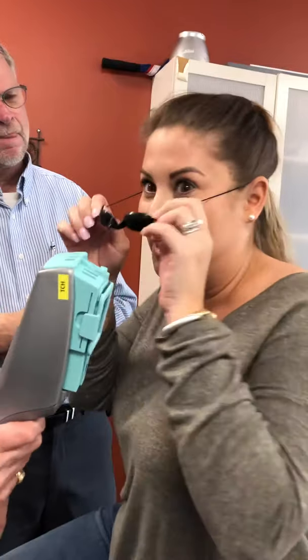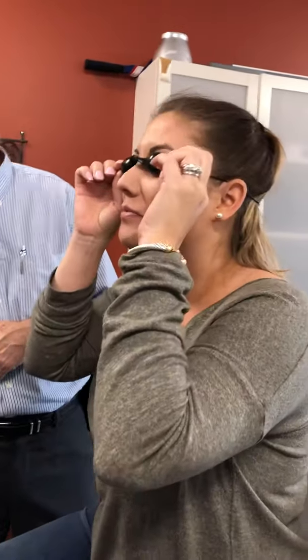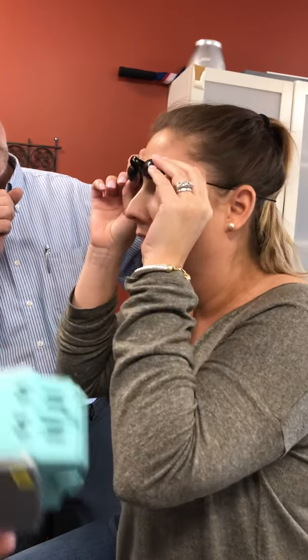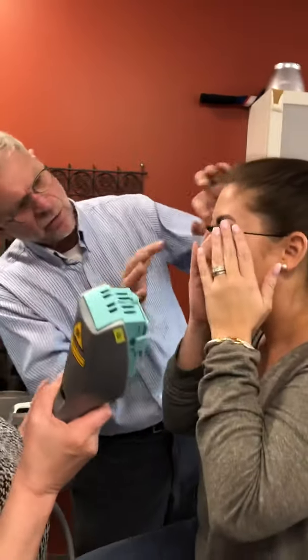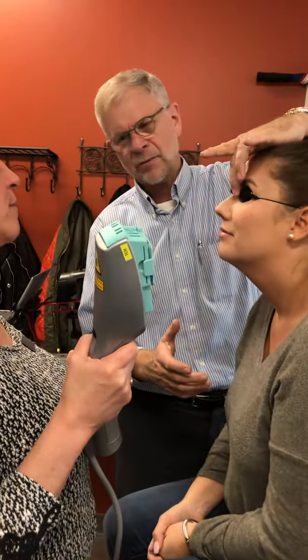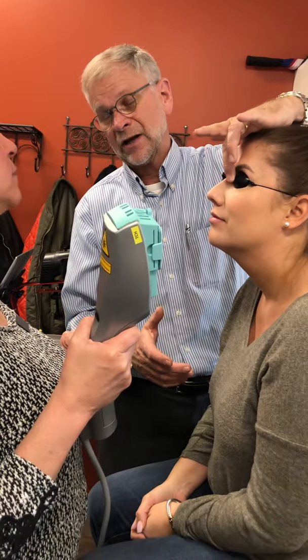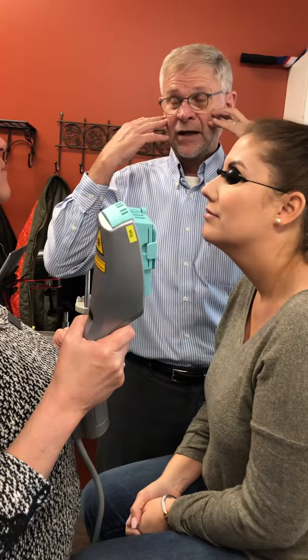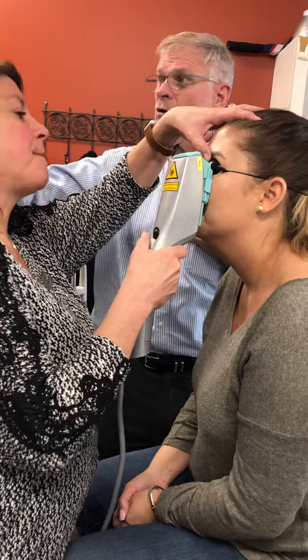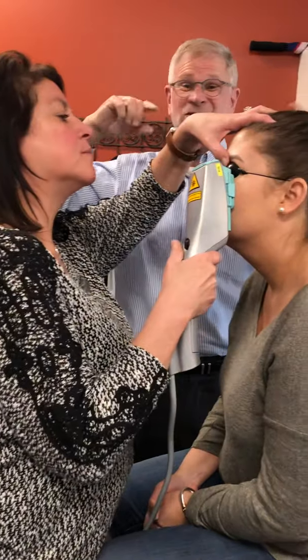All right, so put the goggles back on. It's just hair, no, you won't. So what we're going to do is, once she has the goggles on, I don't have to hold it down. I just press on it, just one button. Okay. So she's got the goggles on nice and tight, and if you feel it's necessary, you can actually take your hand and just press the goggle into the nose or into the face, just to make sure that no light is getting in there, okay? So I'm going to hit enter, okay? You can look directly, and if you have your glasses down, ladies, everybody else, yeah.